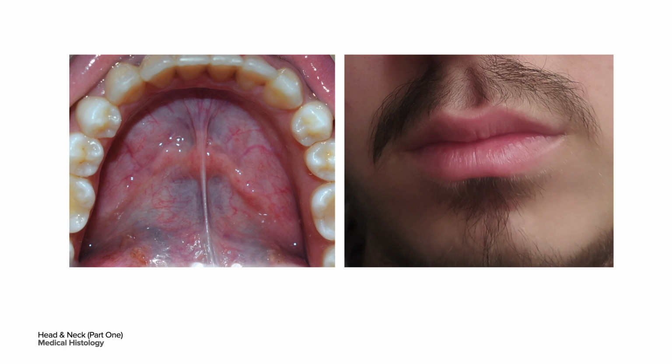In microscopic anatomy, this is made up of an epithelium, usually stratified squamous type. These are orthokeratinized in areas which are exposed to high friction like your palate, non-keratinized in most other areas of your oral cavity, and parakeratinized as mucosa transitions to skin on the lip.